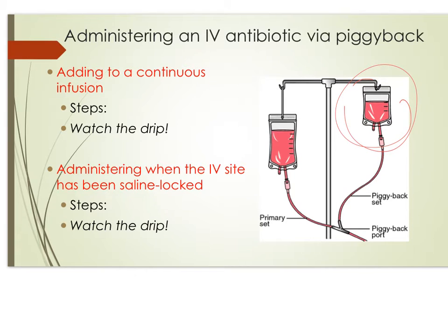Once completed, detach the tubing, recap, and flush the IV site. For subsequent doses using the same tubing, back flush before spiking the new bag. This will clear out any residual antibiotic from the secondary line prior to attaching the new bag.